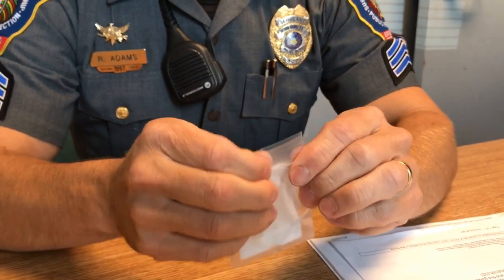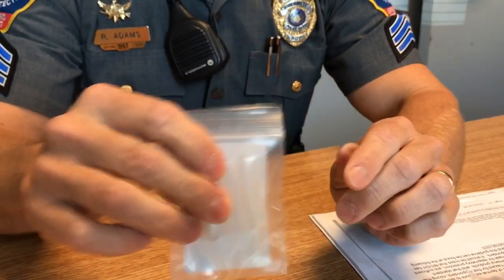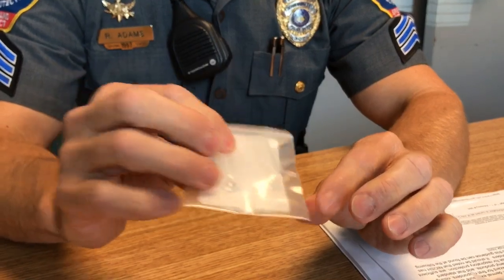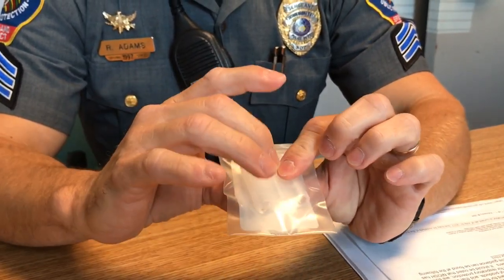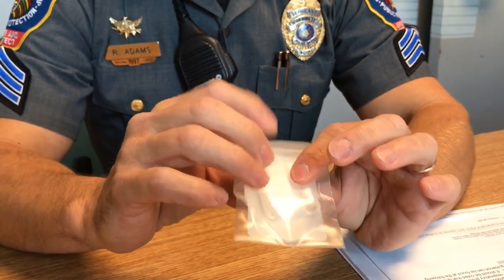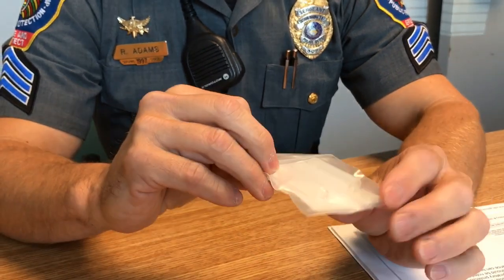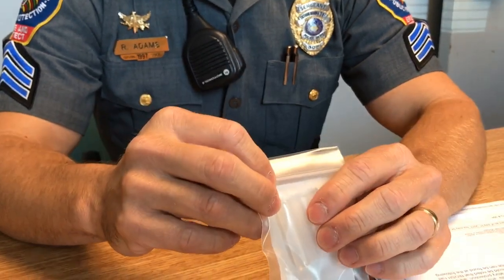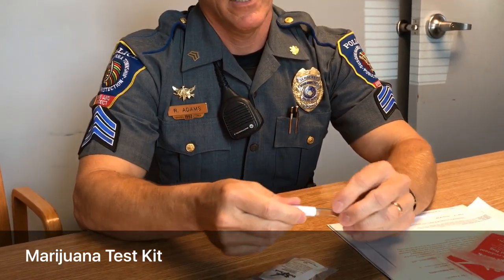Once you get a sample in the very bottom, you zip it tight and then break the first module, shake it around to make sure the substance in the bottom is wet. Then you break the second vial, shake it, and it will show presence of heroin — if it turns green, the clear liquid will turn green, showing the field test is positive for heroin or morphine.